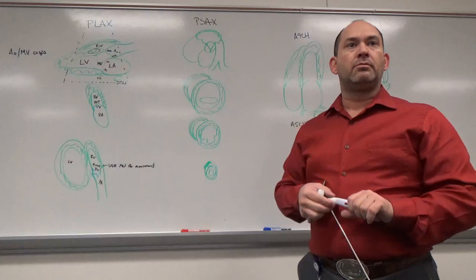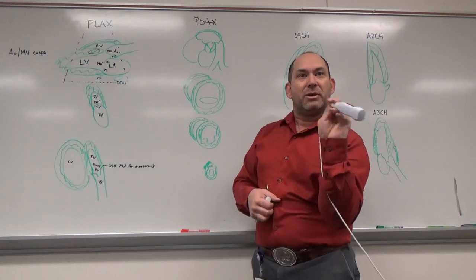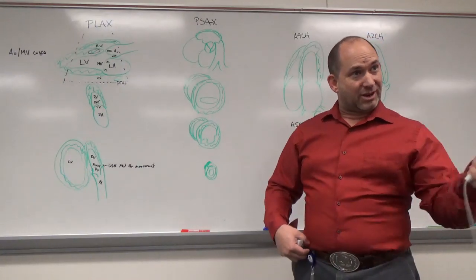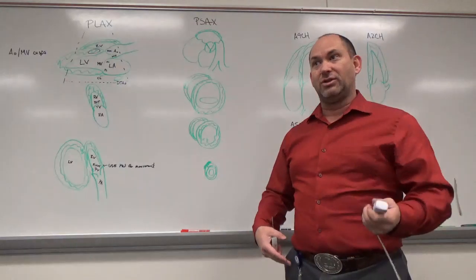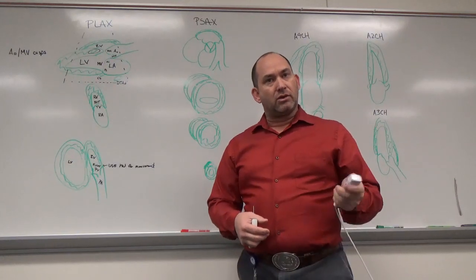So you should pretty much hold as close to the transducer as possible. Yes, the worst thing you can do scanning is try to be like, I don't want to touch the patient. How is it in vascular? I mean, sometimes in vascular you can't get your hand up close because you're literally underneath the folds of the patient and you're trying to hold that transducer. So you do the best you can, but you want to anchor yourself as best you can.